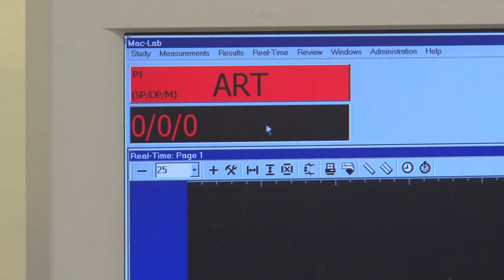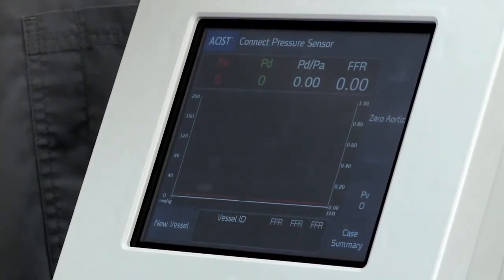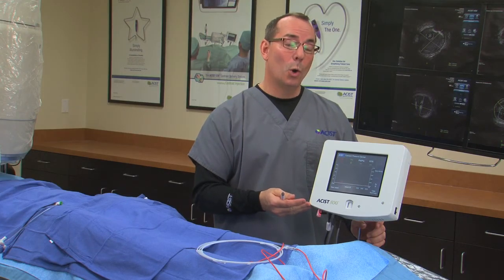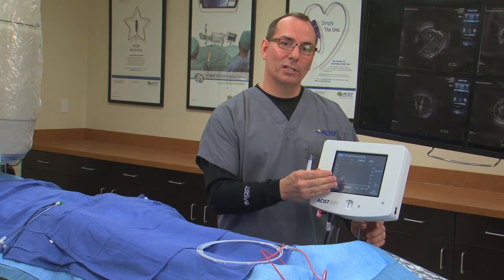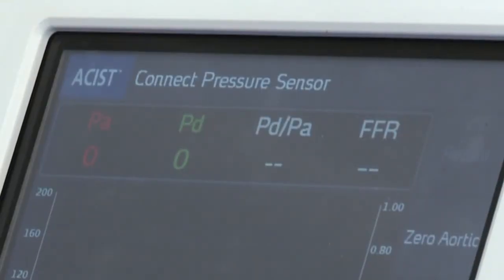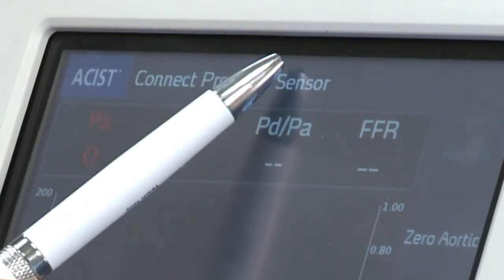Now that the channel is reading zeros all the way across, this is the only time we can zero the RXi system. By pressing zero, we've told this system that whatever signal is coming in — hopefully a zero — is a zero. It has moved whatever signal it was reading to that zero line. Now that we've zeroed this system, the first prompt in the status bar will read: connect pressure sensor.